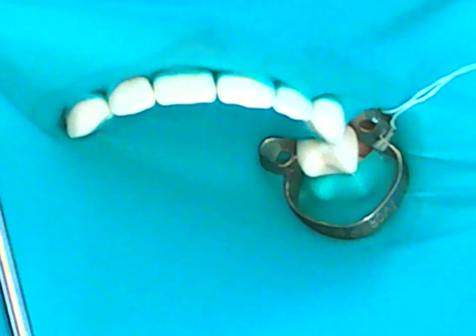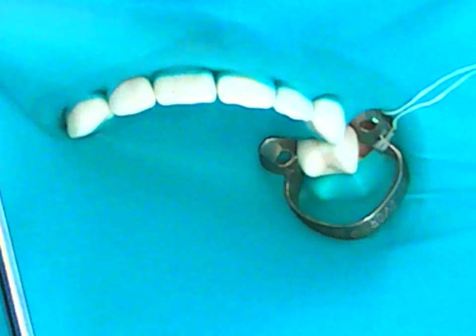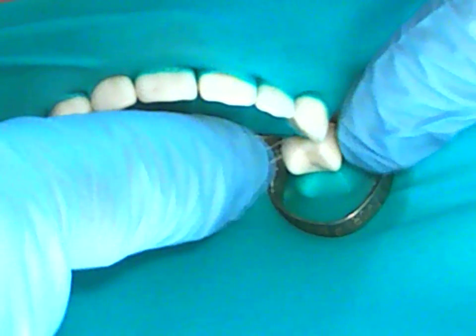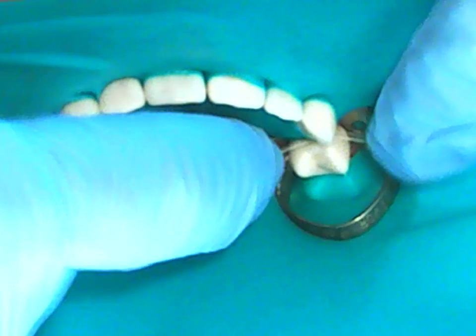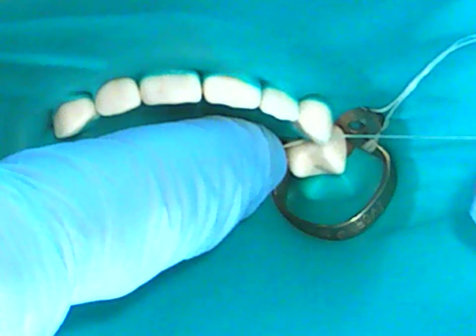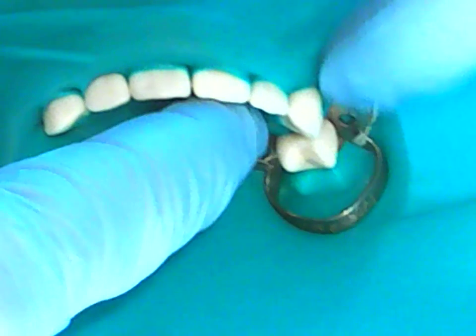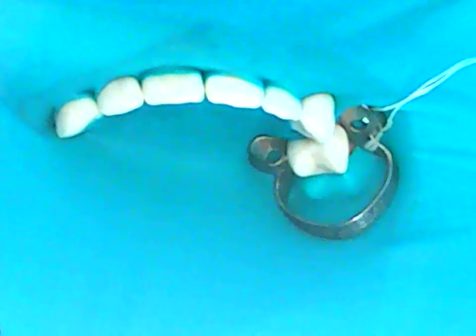Okay, so back to inversion. I'm going to focus on the mesial and distal inversion. How I do that is, with your floss again, once you're through the contacts, you will invert mesially and distally. So you're going to floss again, thinking of inverting on the mesial and distal. This will be the 2-4 mesial. I'm inverting, going up and down using a C shape. Come up until the contacts, go down the distal portion of the 2-3, and I'm inverting the distal of the 2-3 and out the embrasure space.